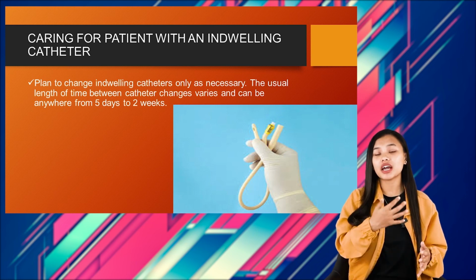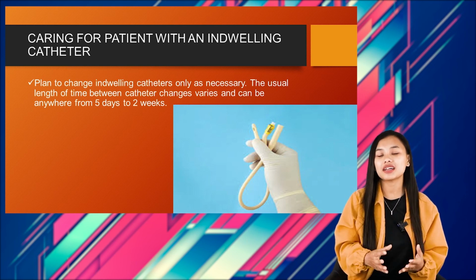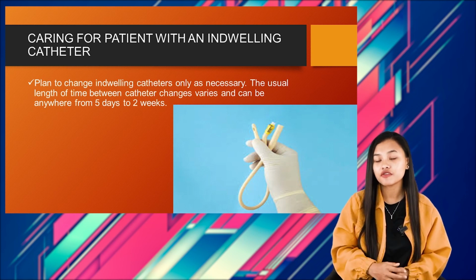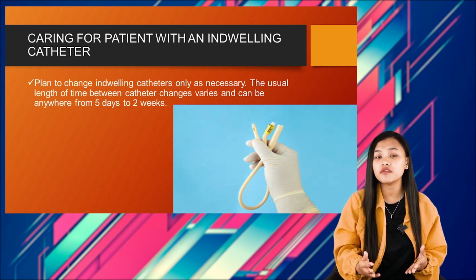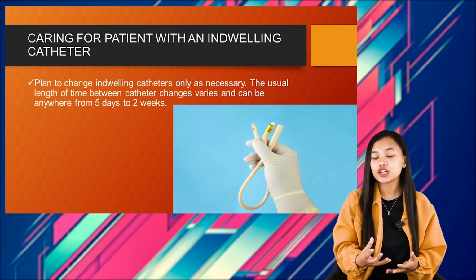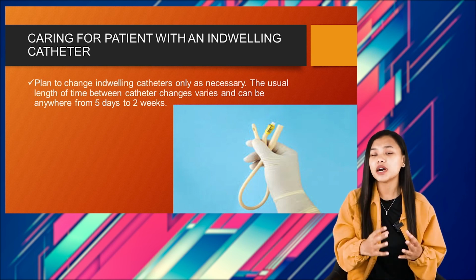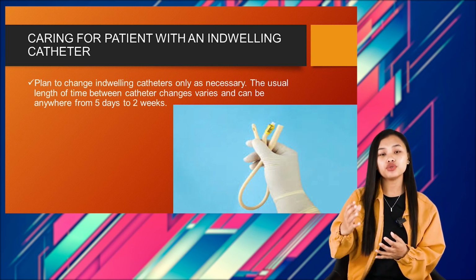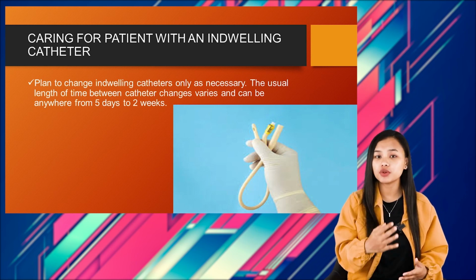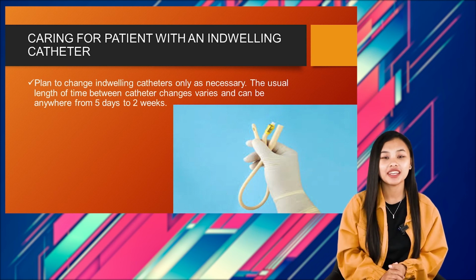So we must properly consult the physician as to till which duration this catheter can be used and when it must be changed, because we cannot use this catheter for a long period of time, but we should not change it frequently either, because if this is done, then there is more likelihood of an infection occurring. So we must not provide the same catheter to the patient for a long period of time, but it must also not be changed frequently, in order to make it less likely for the patient to develop any infection.